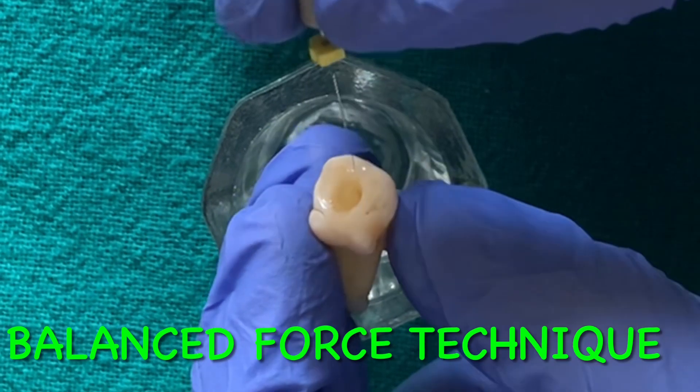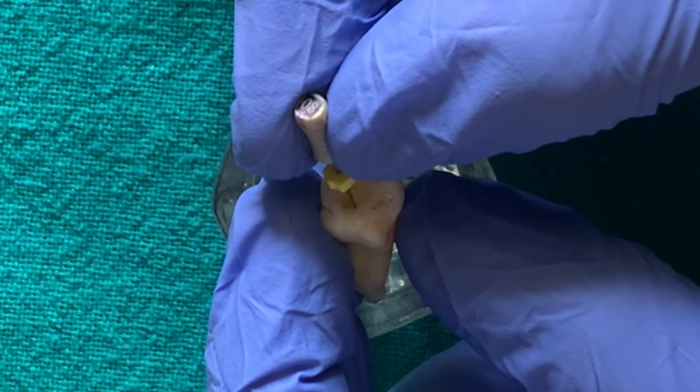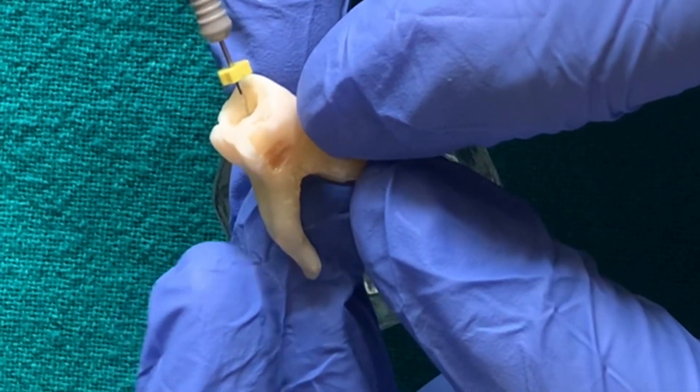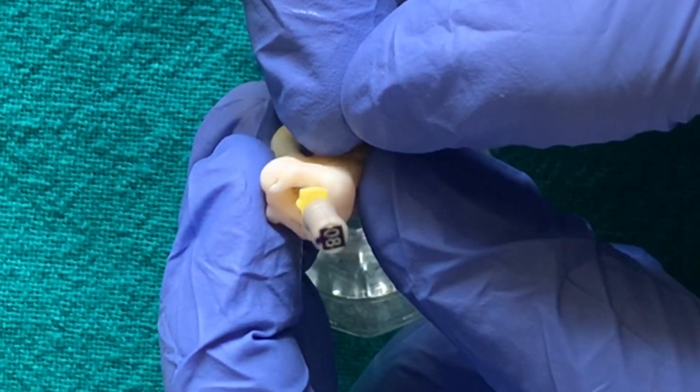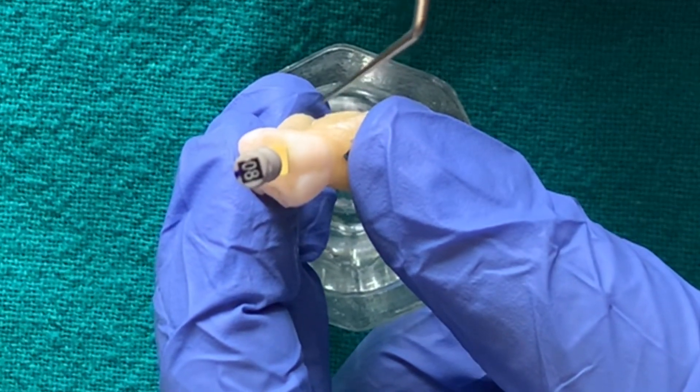The estimated working length is marked on the file and it is inserted in the canal to the point of deepest penetration. We can see that it is short of the working length, indicating that it is a narrow, calcified canal. We are going to do apical preparation with the balanced force technique.